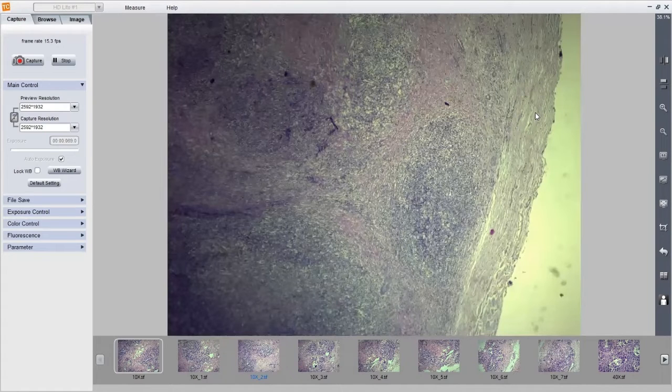When you get a thin capsule, it is something proliferating so rapidly that the lymph node doesn't have time to mount a reaction, like in a Burkitt lymphoma, where the rapidly progressing cells make the capsule very thin. So as of now, we are seeing a thick capsule here, right?